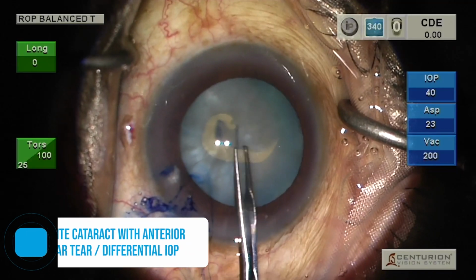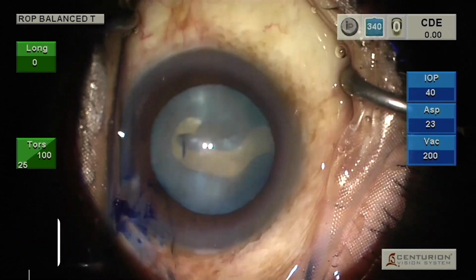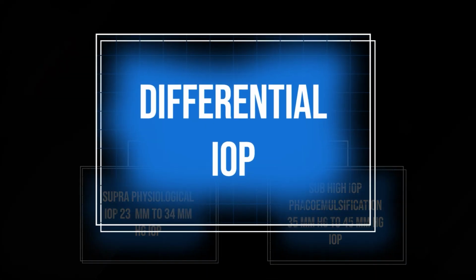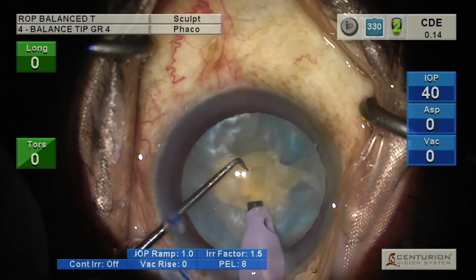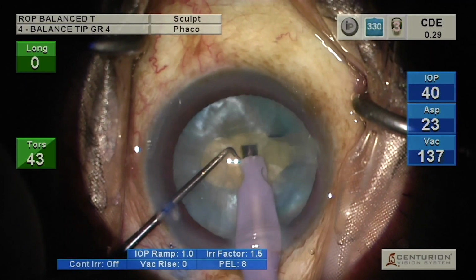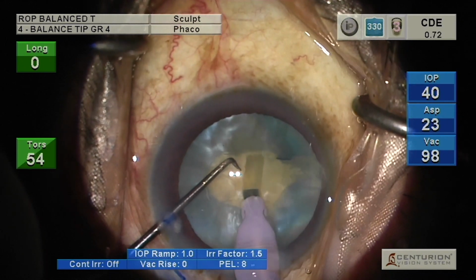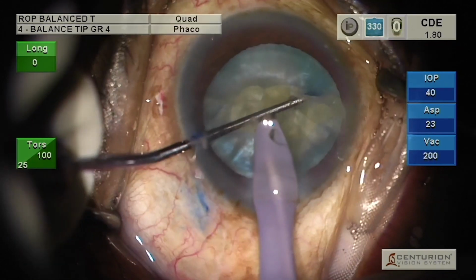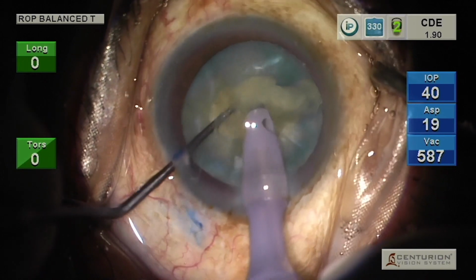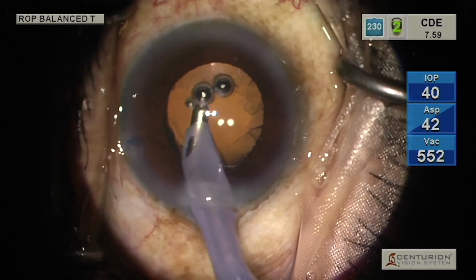In this patient with hard nucleus, in white cataract with anterior capsular tear, differential IOP settings were used. Flap motility sign and safe phacoemulsification techniques with low IOP were employed. Low IOP and stable chamber settings decreased the chances of anterior capsular tear extension to become a wraparound tear. And if by any means the anterior capsular tear reaches equator, it doesn't allow fast posterior extension.